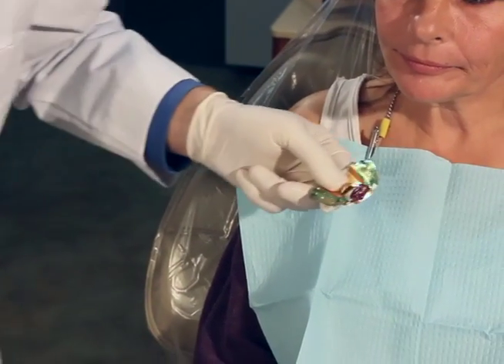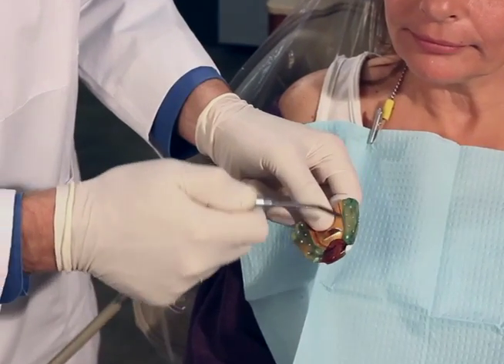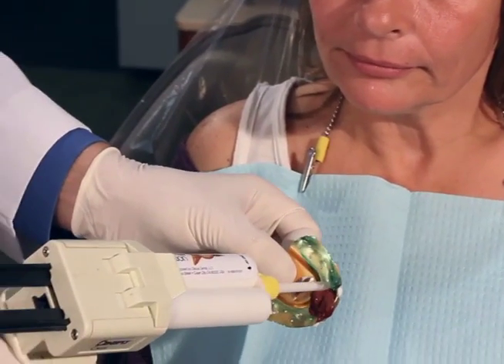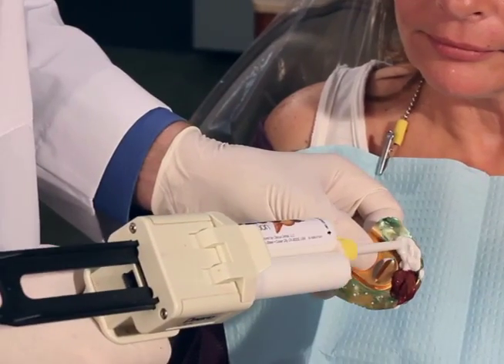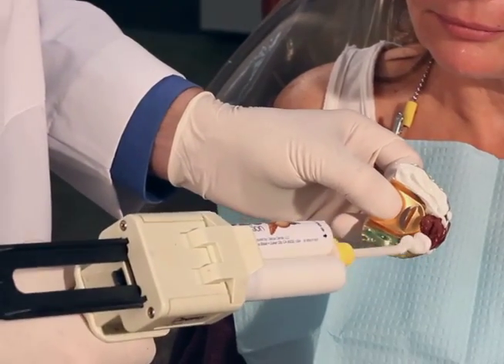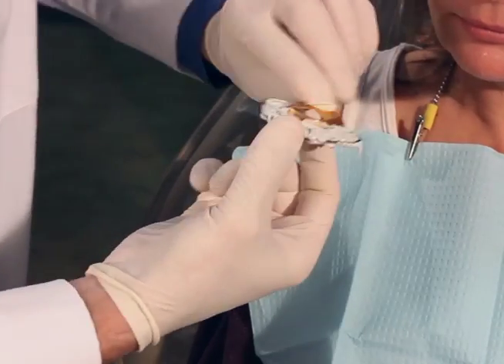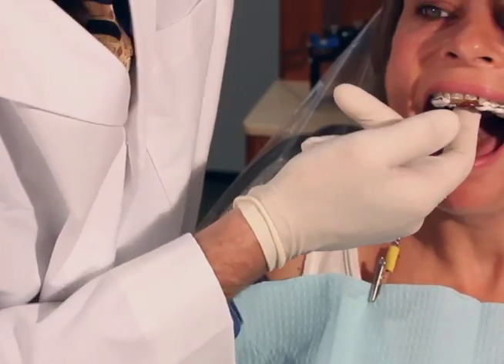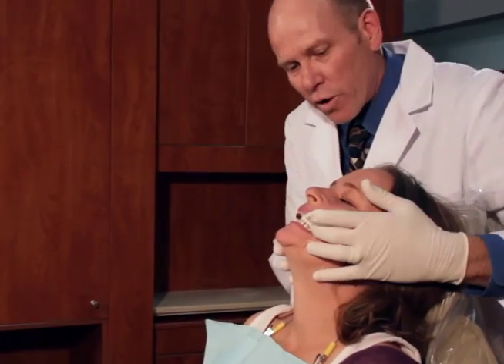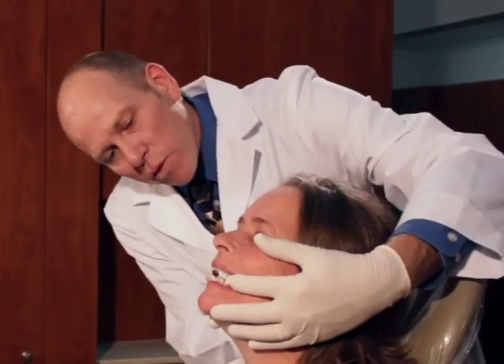In preparation for that, we'll go ahead and air dry the lower half of the tray. Now we're going to inject a much larger amount on the posterior area because we do have that space between the posterior teeth. I'm going to inject a much larger quantity of bite registration material onto both sides. We go back into the patient's mouth, index against the upper teeth, have them bite into their index while I hold the tray up, making sure they don't clench but bite up in there. We'll hold that in place while the material sets.